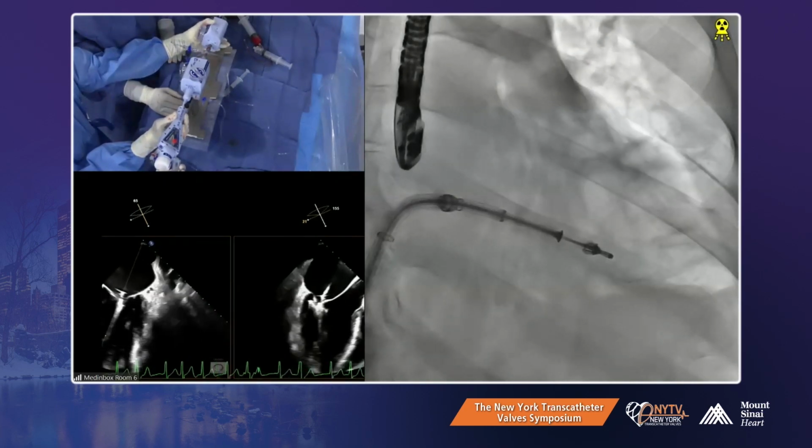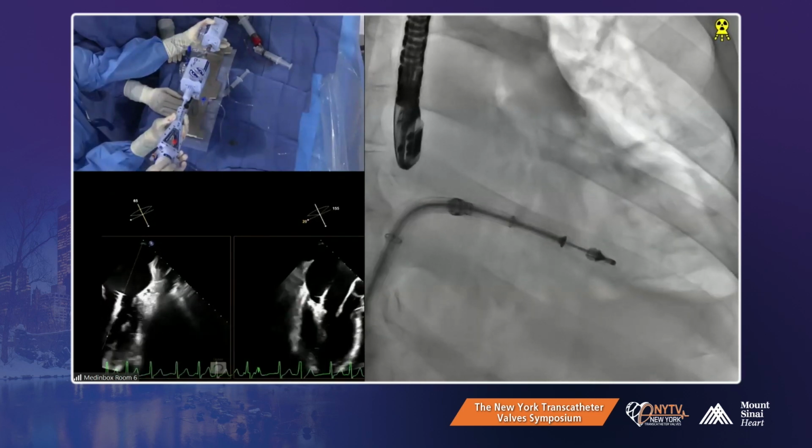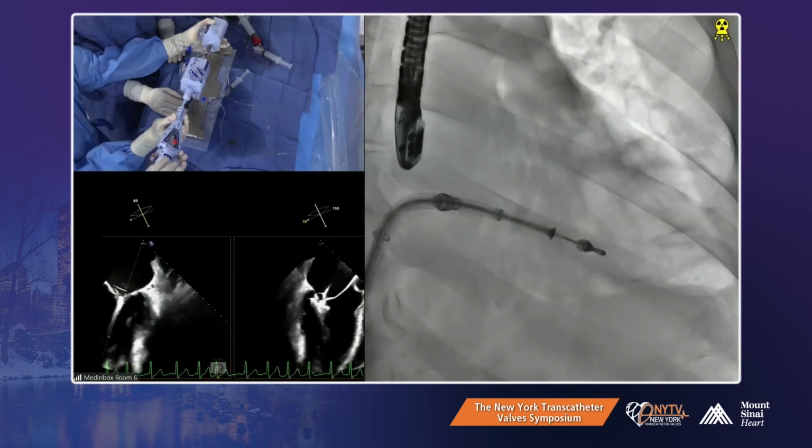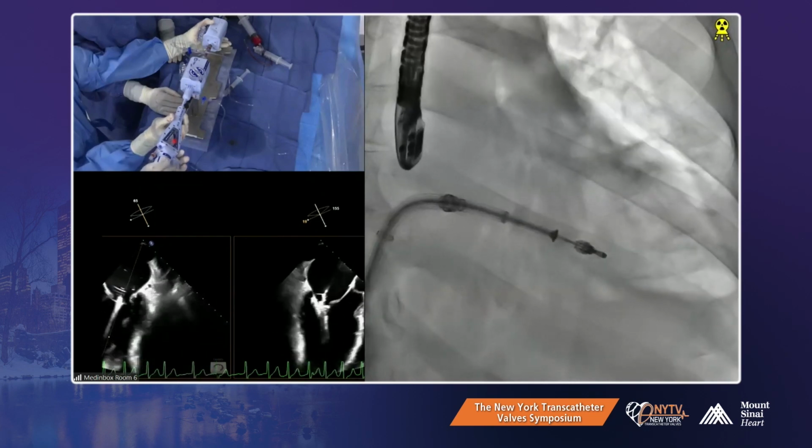Close the clip a little bit. Yep, close it to 120, otherwise the anterior will fall off. Correct, in posterior. Yeah. Don't close too much. No, close too much.